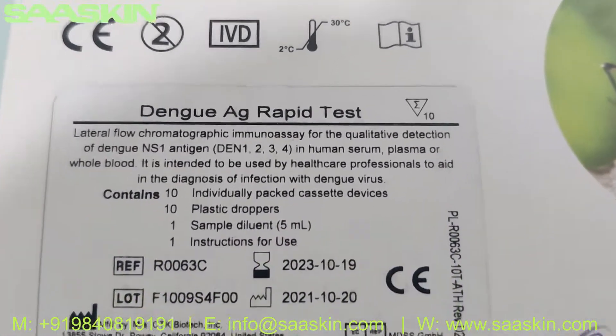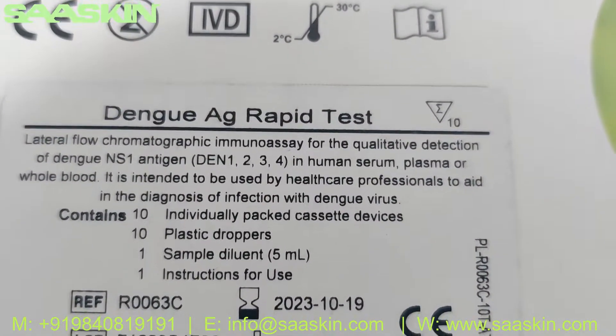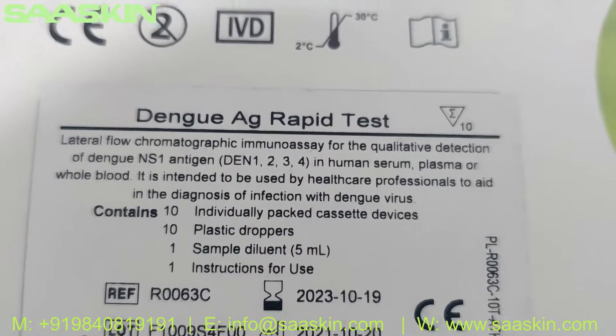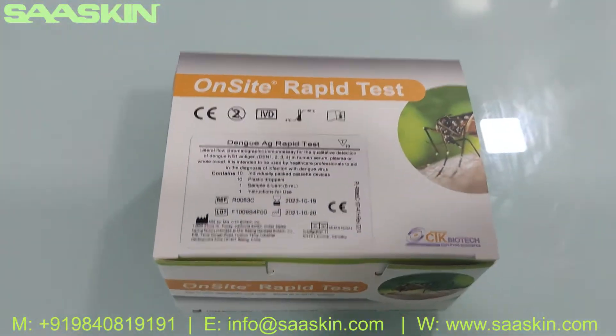It is for the qualitative detection of the Dengue antigen. You can see it is for human serum, plasma or whole blood. This is how the box looks like — it is from CTK, on-site brand.